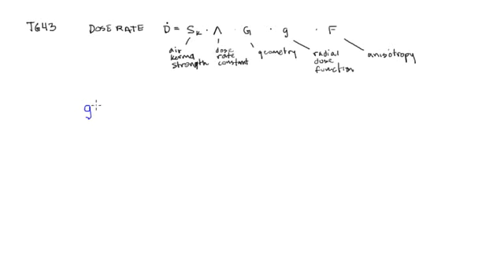Now we're going to go on and talk about this factor small g, the radial dose function. It accounts for absorption and also scatter in the medium where the brachytherapy source is embedded. And that's going to depend on the properties of the radioisotope, in particular the energy, as we'll see in a minute. If you have a source here, g is just a function, as you go out from the center, just a function of the radius along that line, the distance r.